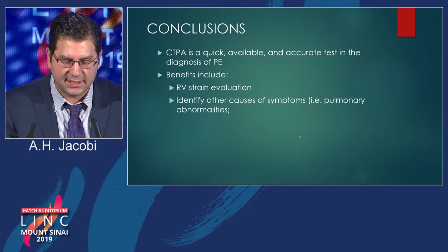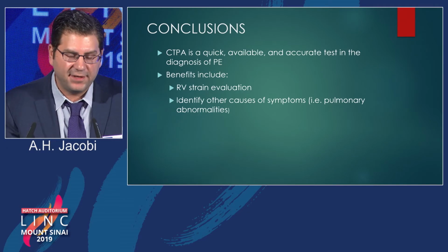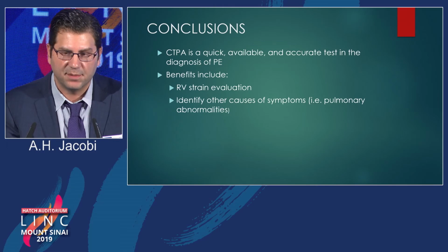So in conclusion, CT is a quick, available, and accurate test. The benefits include RV strain evaluation and identifying other causes of potential symptoms, like in the lungs themselves.